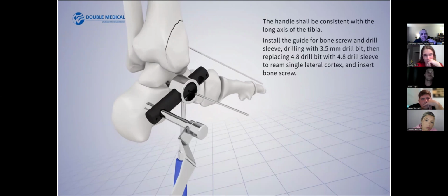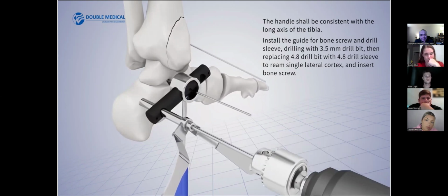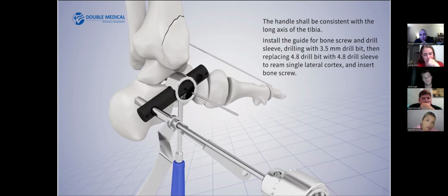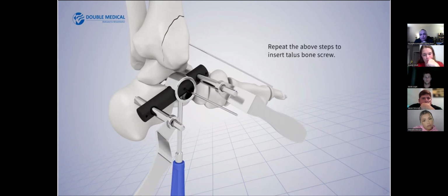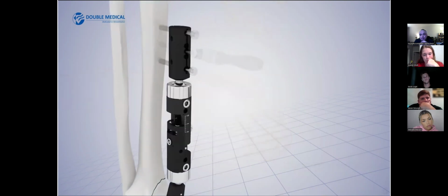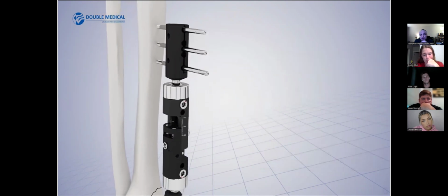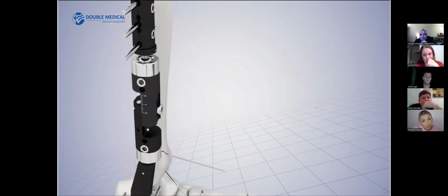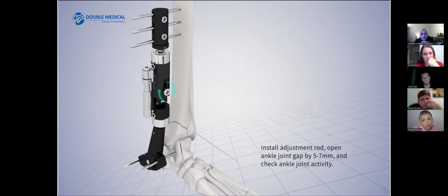We have another one for the tibia. Whenever we want to insert something inside the bone, we need to make a hole for it to be inserted by a drill, unless we have a drill tip. We will discuss it later in the design of the screws. We have self-drilling screws, but if they are not self-drilling, first we have to drill the bone. We don't insert the pin directly into the bone, except for very thin things like the 1 millimeter.